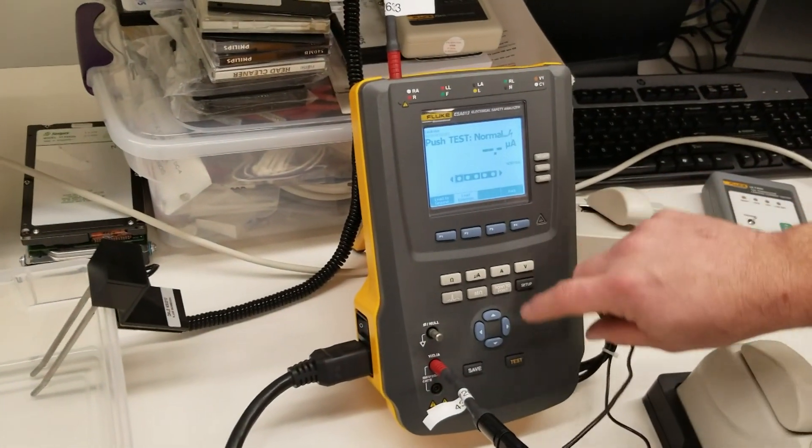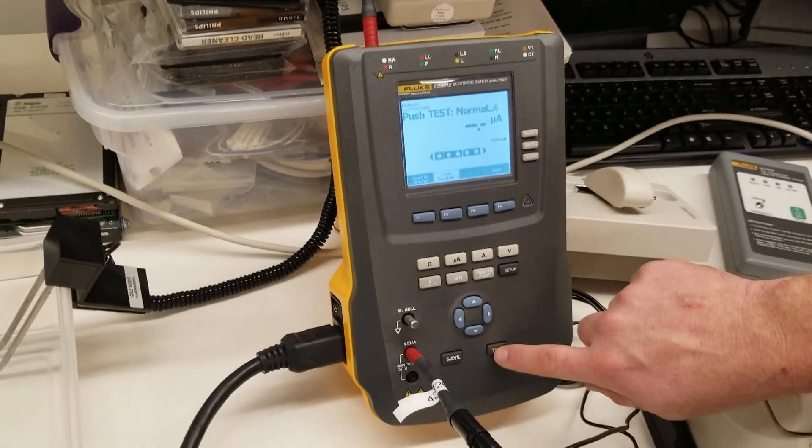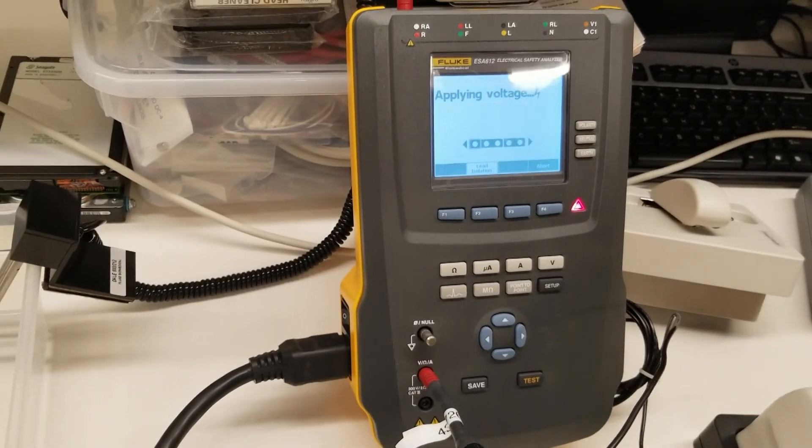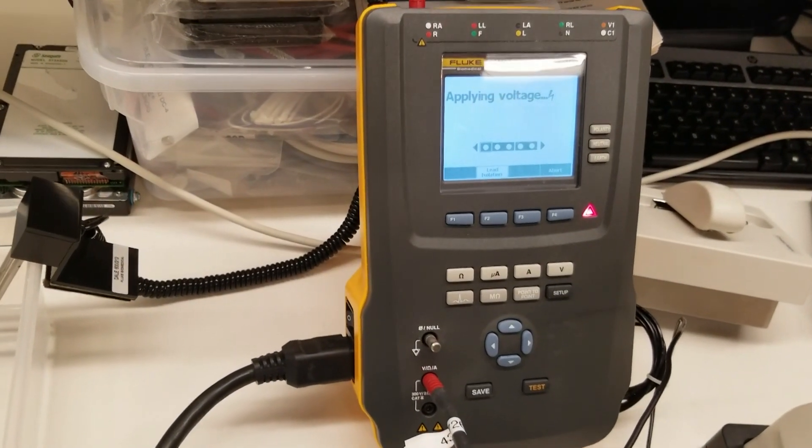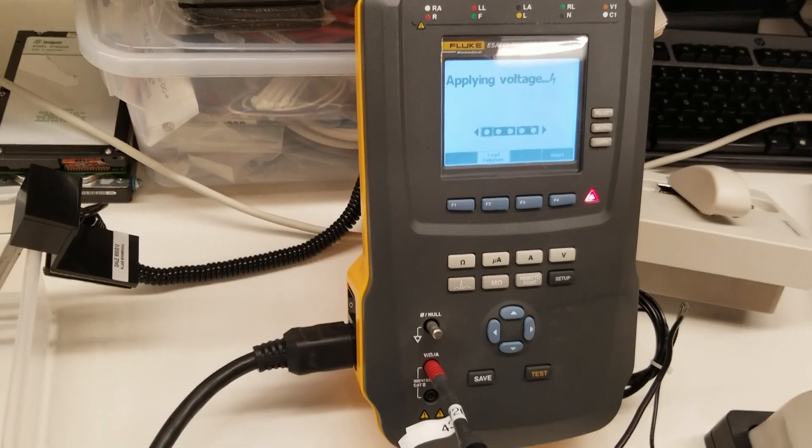And we're going to go ahead and push test. Red light's on and once it shuts off we'll have our reading.